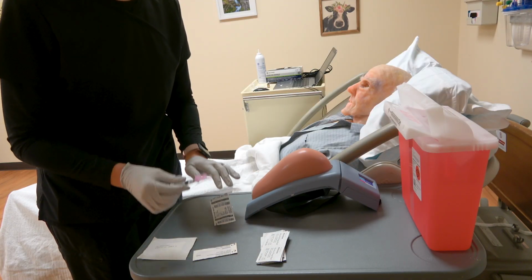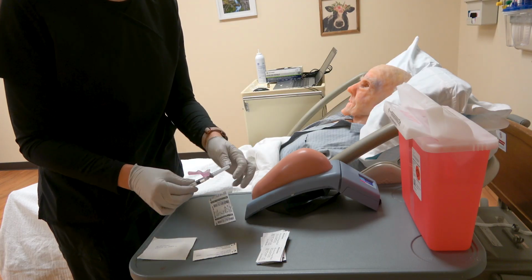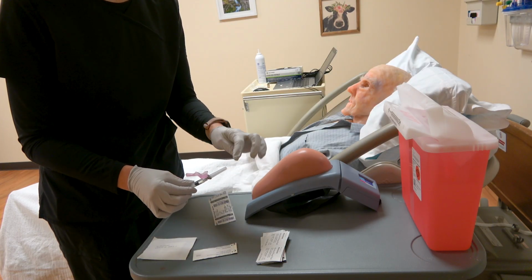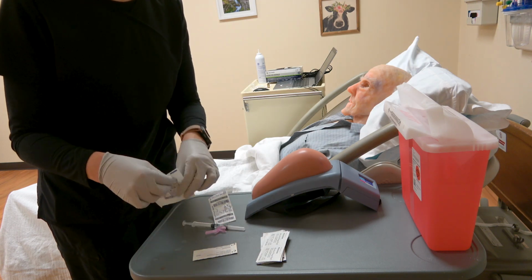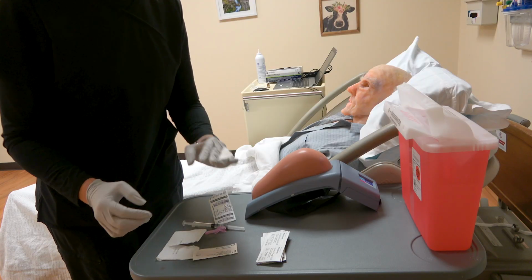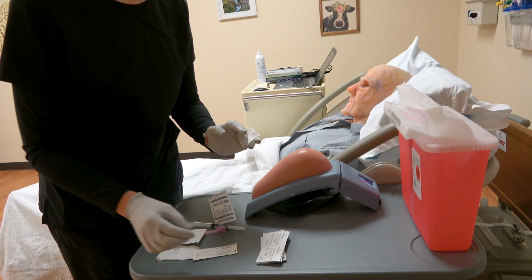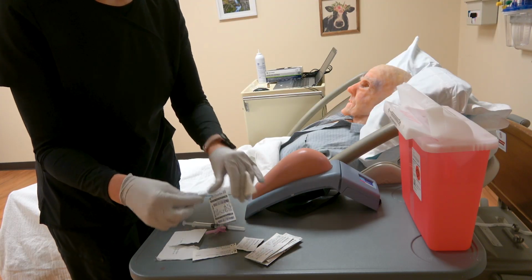Okay, so now this is our needle. We're going to go ahead and take our safety back. This is our cover that's covering that. Once we take that off, we cannot recap it. I'm going to open up my gauze pad, and I'm going to have that between my 3rd and 4th fingers on my non-dominant hand. And then I'm going to clean my area.